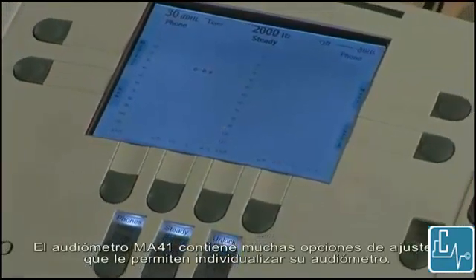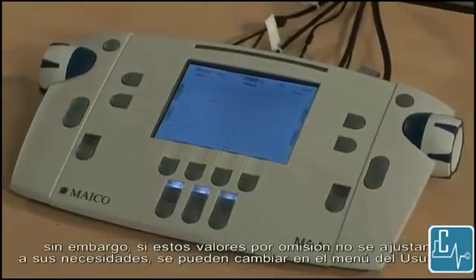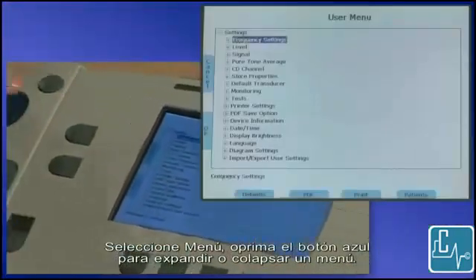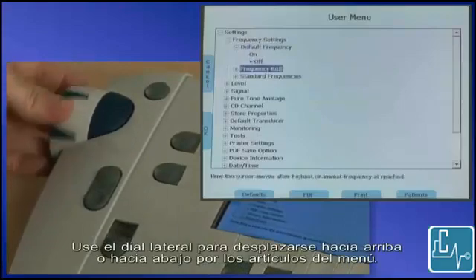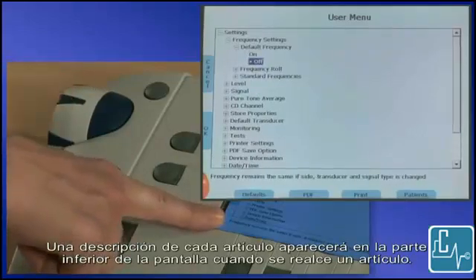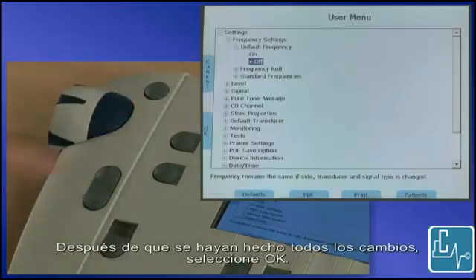The MA41 audiometer contains many setting options that allow you to customize your audiometer. Default settings have been chosen to accommodate the most common uses. However, if these default settings do not meet your needs, the settings are easily changed in the user menu. Select menu. Press the blue button to expand or collapse a menu set. Use the side dial to scroll up or down through the menu items. A description of each item is displayed at the bottom of the screen when an item is highlighted. Use the blue button to select and change an item. After all changes have been made, select OK.